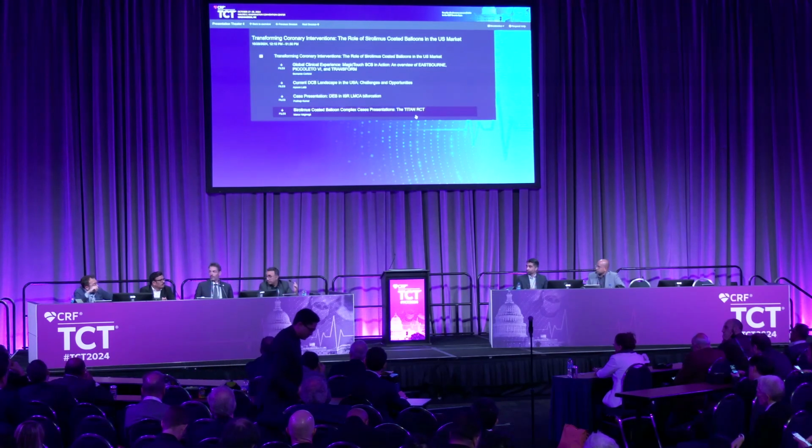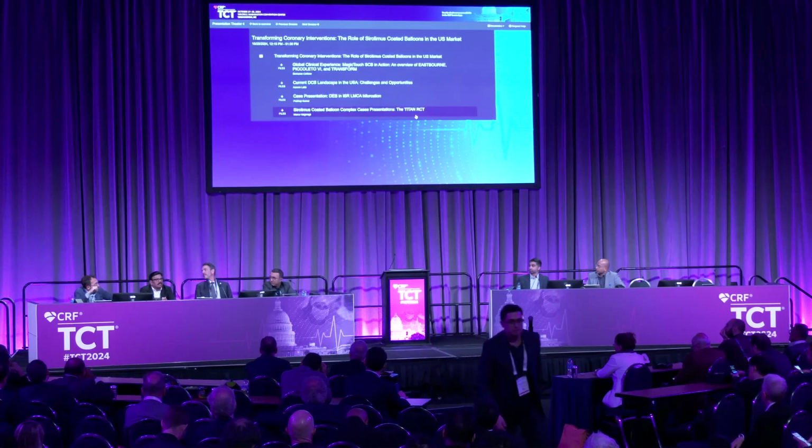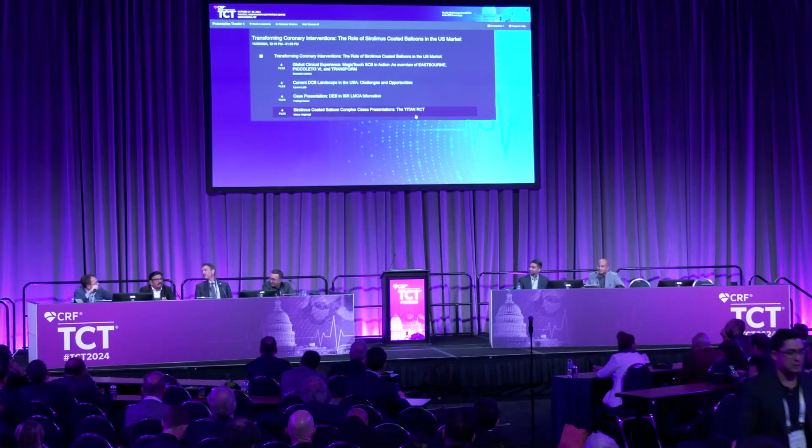I agree. And we use FFR because it's very difficult to know when to stop and how to stop. And that's why at least we have an objective measure. We can discuss whether it's bad or wrong, but at least we have a measure.